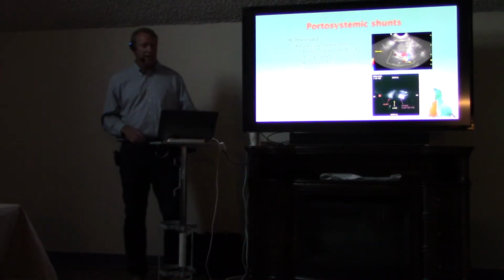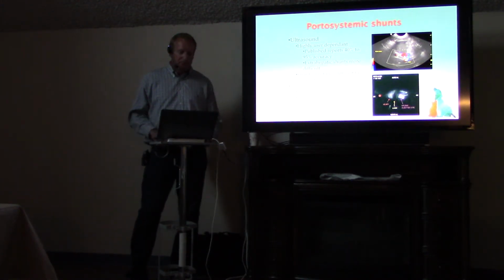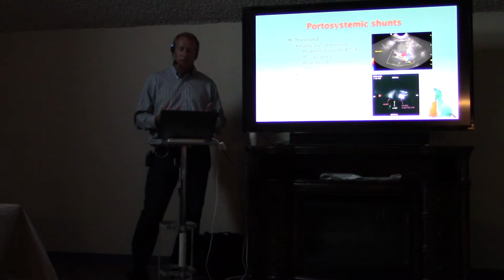The most common of these would be an evaluation of portosystemic shunts. And there's a lot of different ways of imaging shunts. Ultrasound is probably the most common method of diagnosing portosystemic shunts, but this is very user dependent. You have to have a very strong understanding of the vascular anatomy in the cranial abdomen. You have to be able to use Doppler ultrasound and feel comfortable with that.